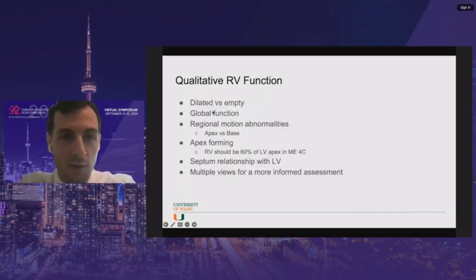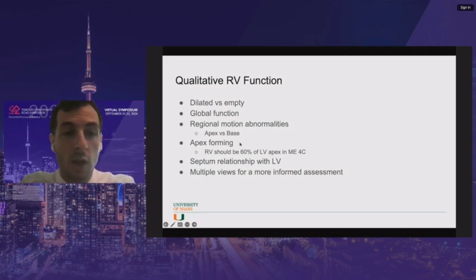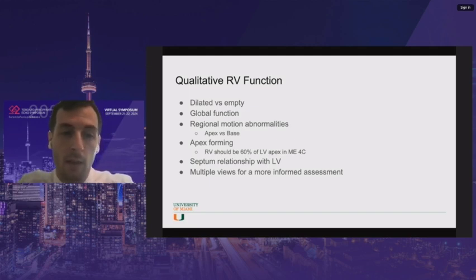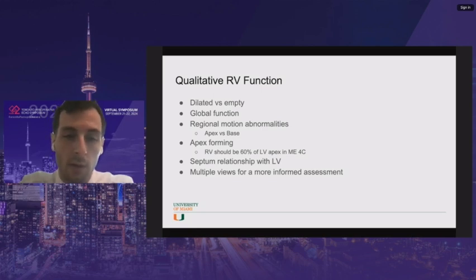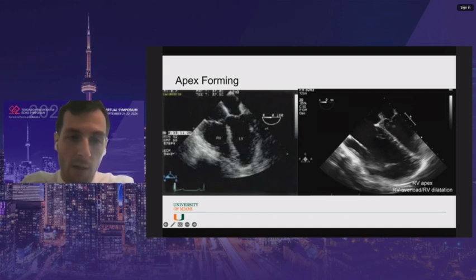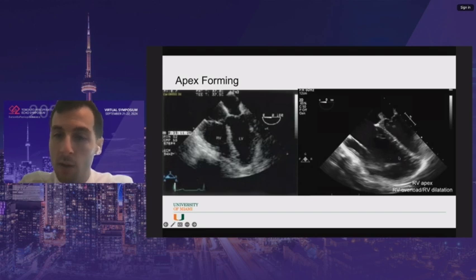That's my argument for using qualitative assessment. Look at the RV: is it dilated or empty? Is global function good? Are there regional motion abnormalities? Is the apex moving more than the base or vice versa? Is the RV apex forming — meaning is the RV more than 60% of the LV apex? And how does the septum look relative to the LV? These questions can be answered quickly from one or two views, though more views give a more educated assessment. Apex forming ranges from a normal small section to a completely dilated, volume-overloaded RV — you can't miss it.